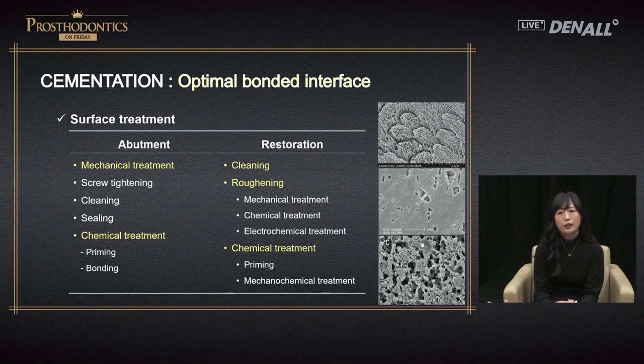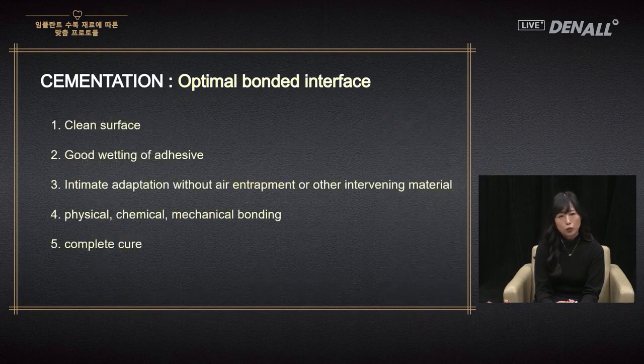To do this, you need surface treatment on the abutment and restoration. To get good cementation, the following 5 factors need to be satisfied. I'm going to talk about ways to achieve this.